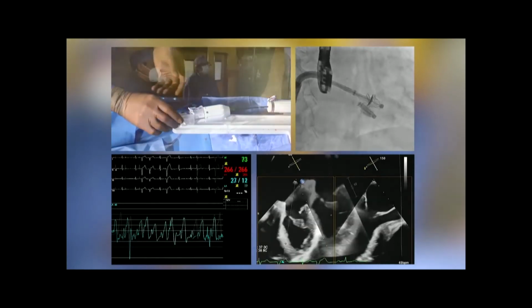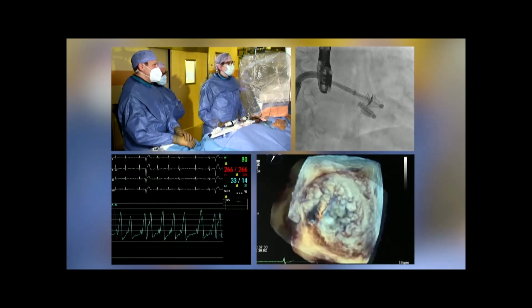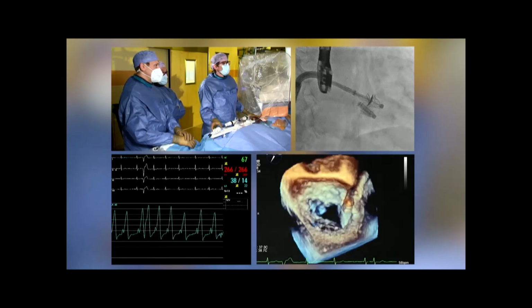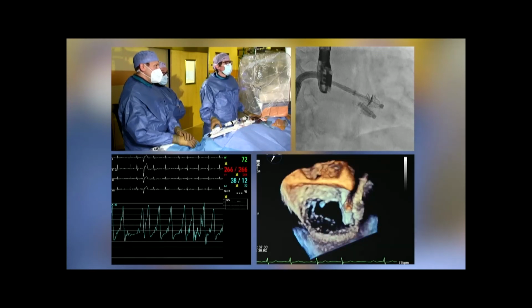Okay, anterior is down. We even came above the posterior now, but that's fine. We fix it in a second. Clocking anterior, you're very close to the first device. So clocking is fine, right? Yeah. Or do you want? No, I think it's good. Huh? Yeah, Kilo. All right.